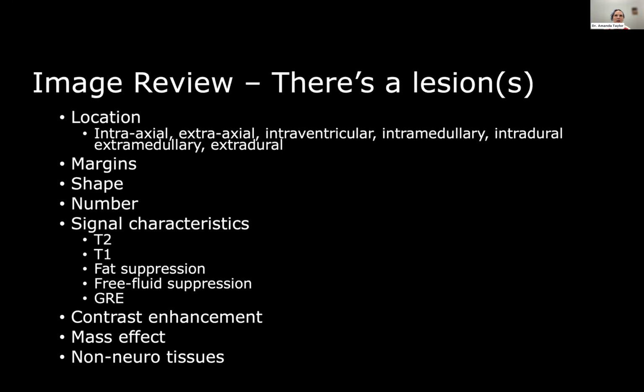So I guess when I started doing this as a resident, the way that I kept myself from forgetting was actually going back to this list. I had this list written down next to me. And if I'd forgotten to bring it, I would write it down on the top of the paper that I was taking notes on, quite honestly. Now it's not actually something I usually have to think about. I usually just do it. But once I've found something, I try to ignore whatever it is I've found and look everywhere else to make sure there's nobody else there that I should be concerned about.